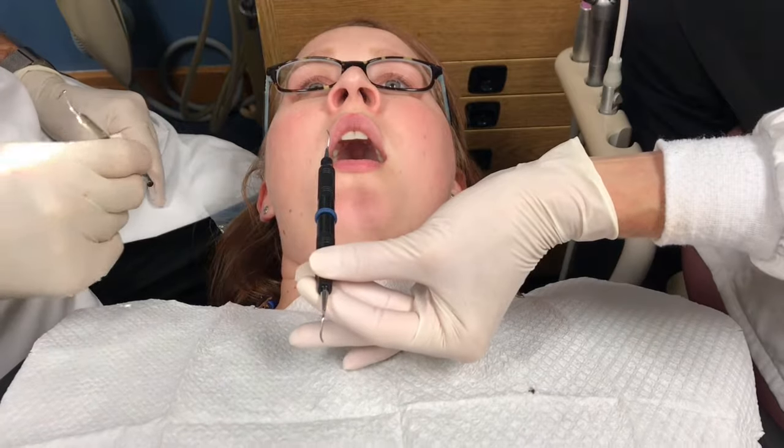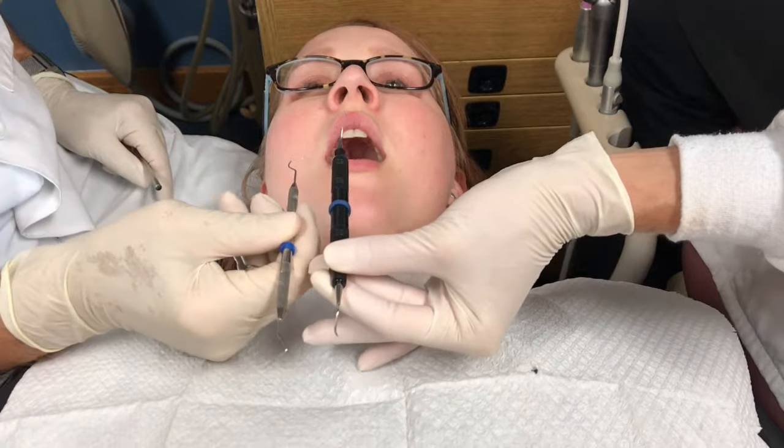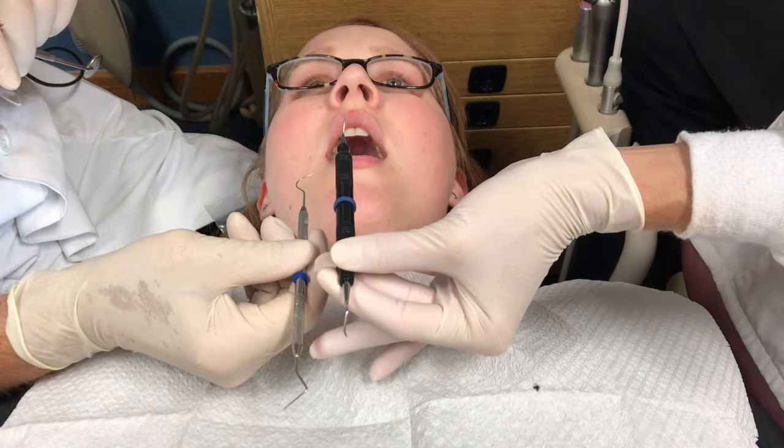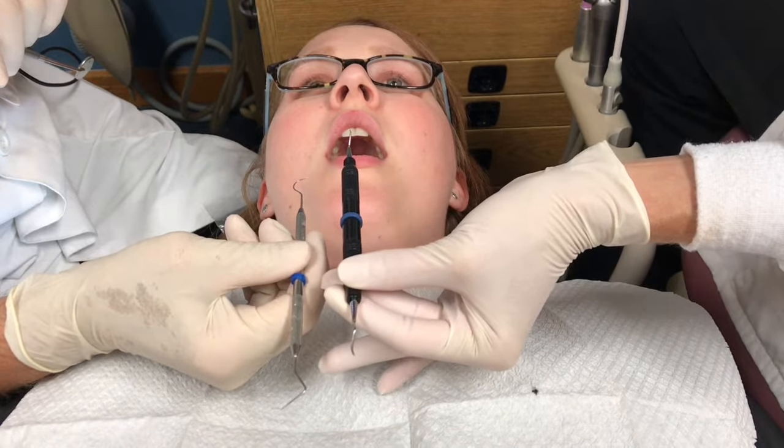Most instruments have two ends. Transfer the instrument from the tray into the transfer zone, ensuring that the instrument is parallel to the instrument in the dentist's hand.